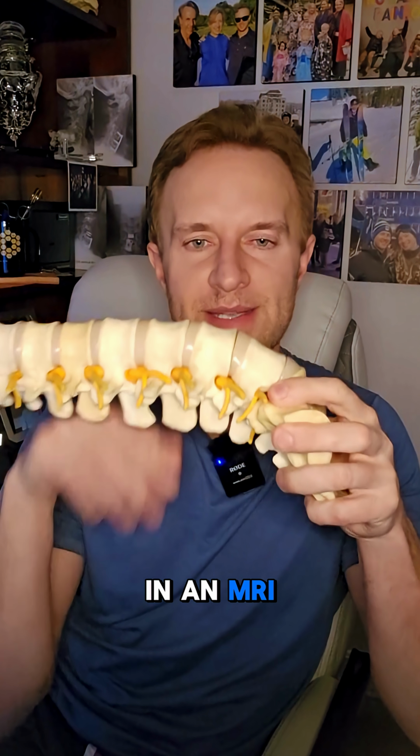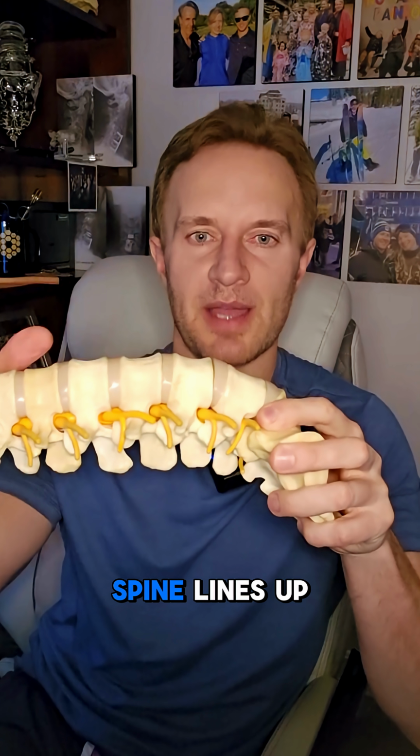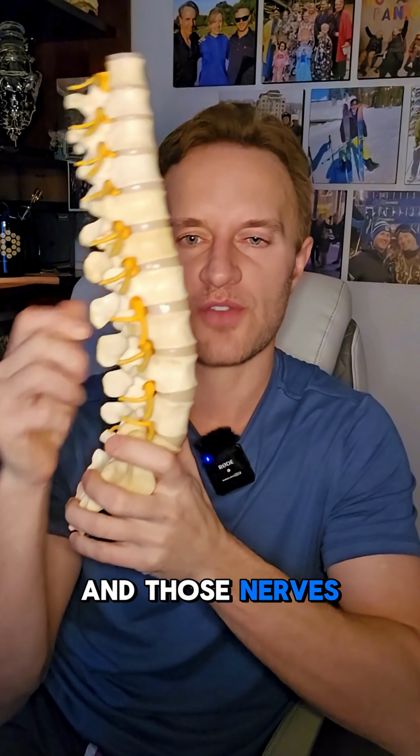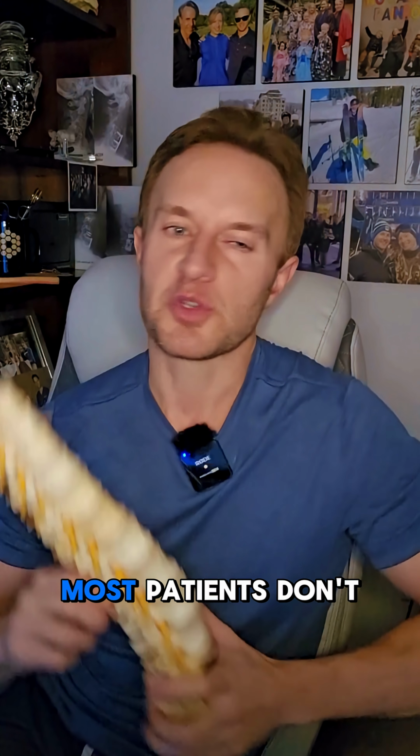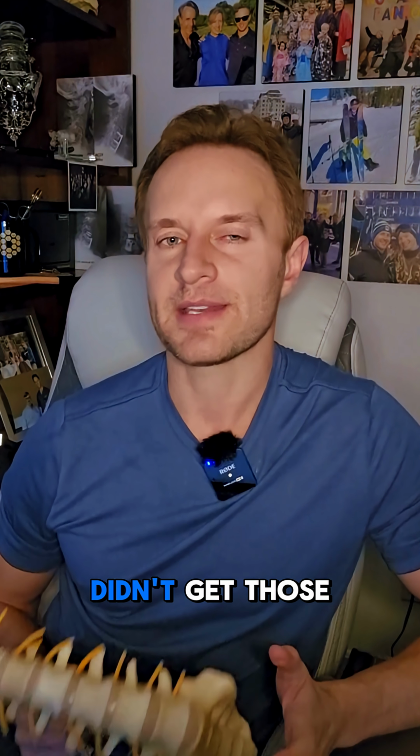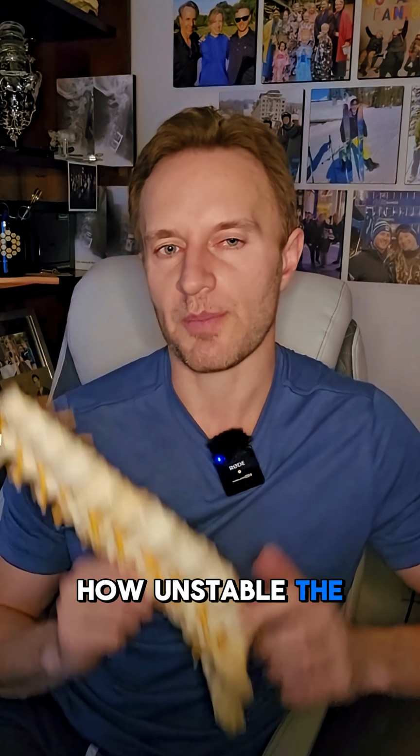When you're lying in an MRI scanner, that instability goes away and the spine lines up. When you stand up, like in these X-rays, the bone slips forward and those nerves in the back become pinched off. Most patients don't have symptoms when they're lying down or sitting down for this reason, so if I didn't get those X-rays, I wouldn't know how unstable the patient's vertebrae are.